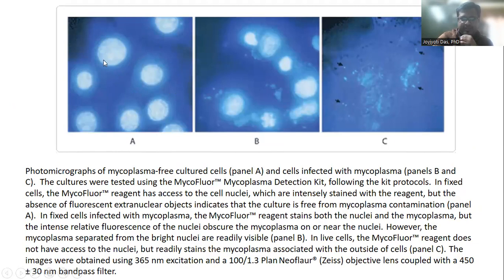You can see here that the animal cells show a clear, well-defined nucleus, circular in shape, big circles, and there are no other dots around the nucleus. But in the second case, you can see small blue dots appearing near the big circles.